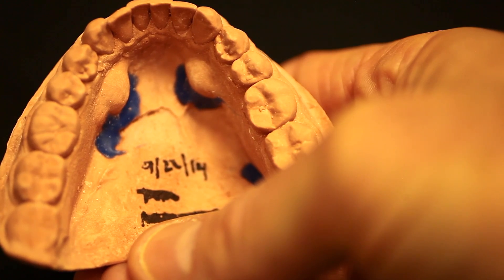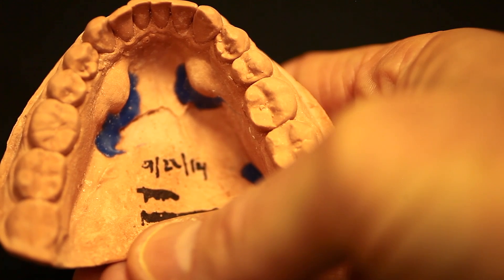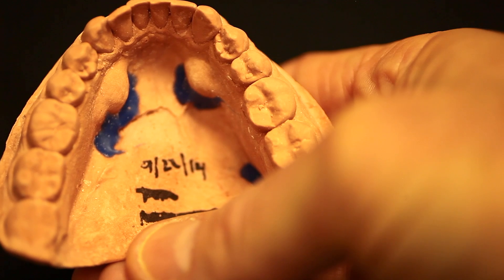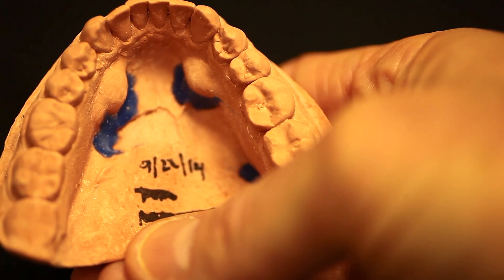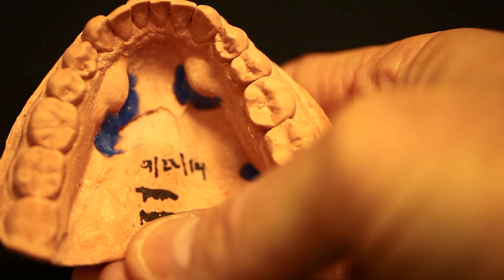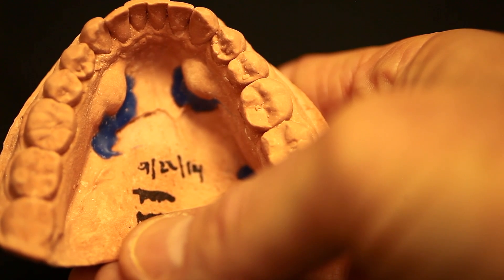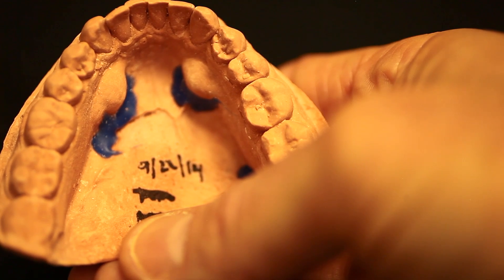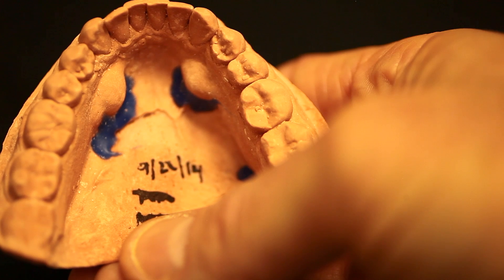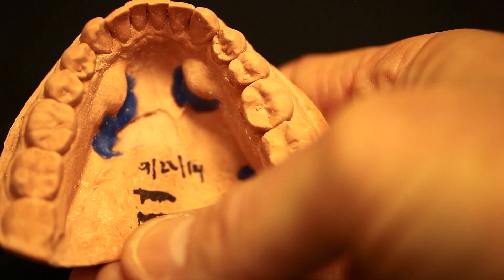Now that we've verified the accuracy of the model, there are a few things you want to do to prepare it before you duplicate it. You'll notice this patient has some pretty significant tori. If you block those out, or any other severe undercuts that aren't critical to your diagnosis, it will make the duplication process much easier and the retrieval process out of your silicone mold much easier as well.